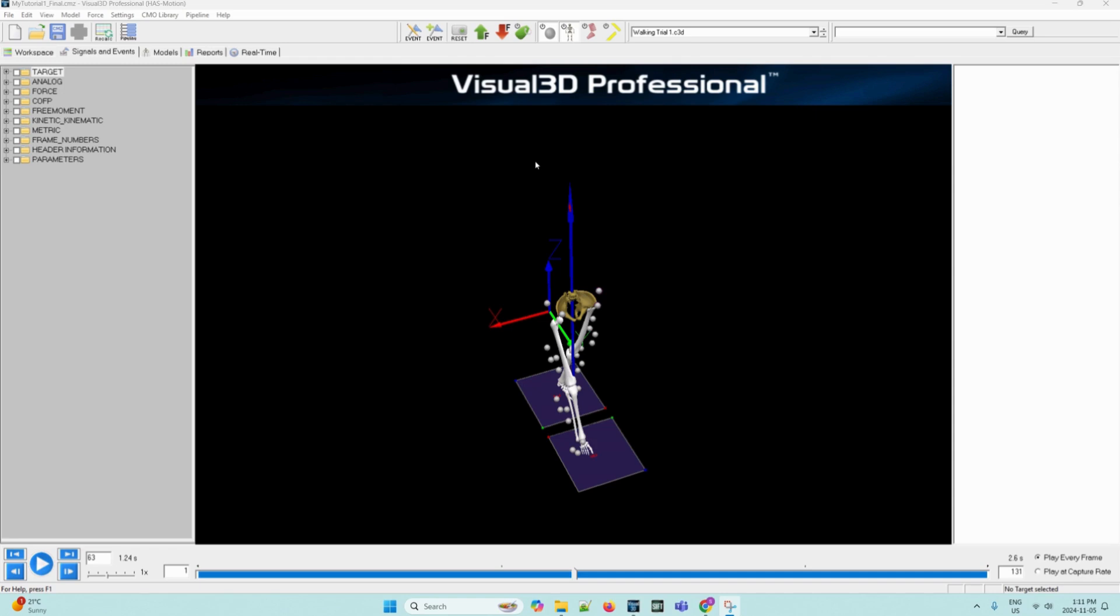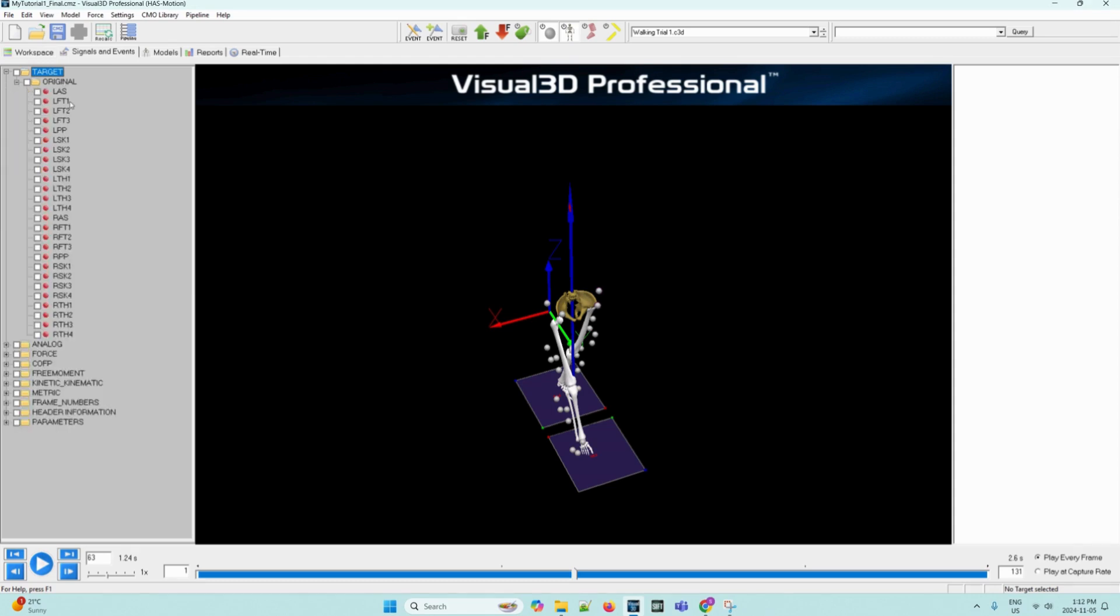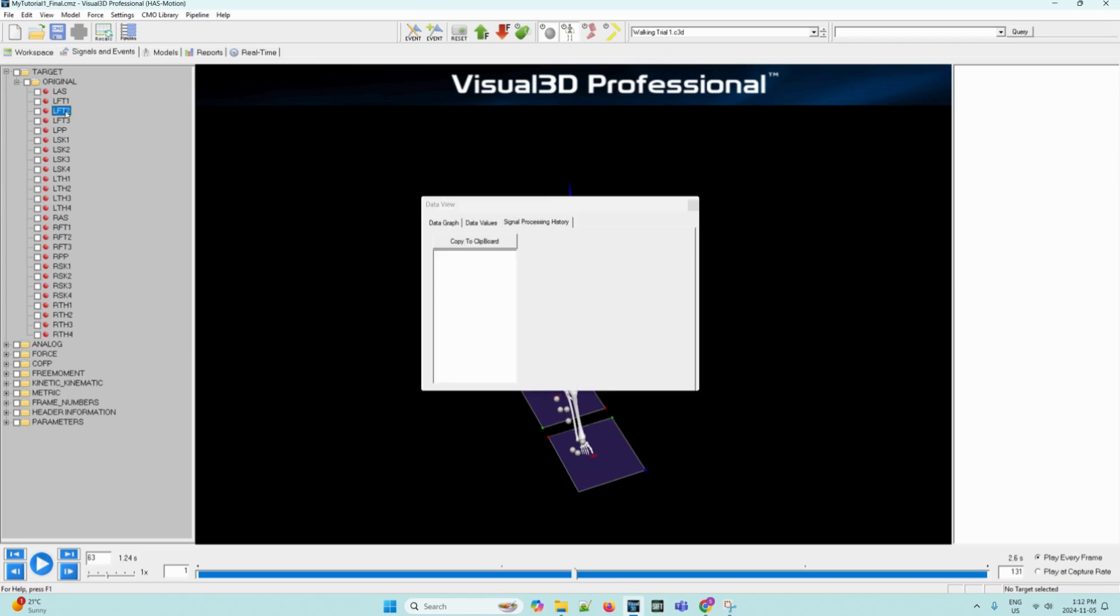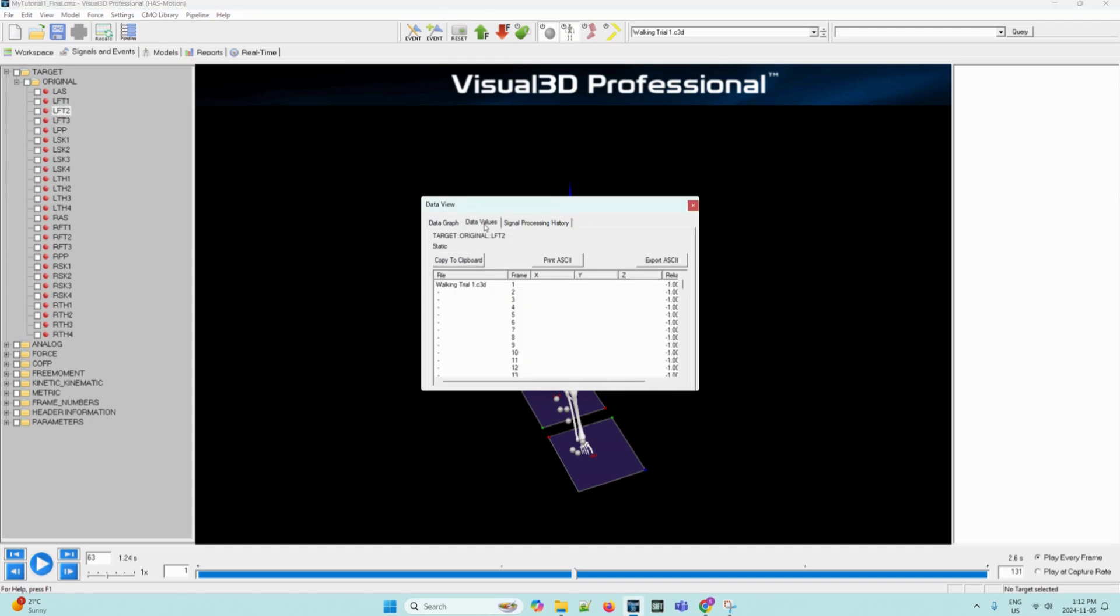First in the data tree on the left, the folder with the original signal should already be open, but if it isn't, do the following again. We can click the plus sign next to the target folder and then click the plus sign next to the original folder to expand the C3D files available. Then we can click on the marker labeled LFT2. We can left click on it. Now this will open the data view dialog box and we can navigate to the data values tab.